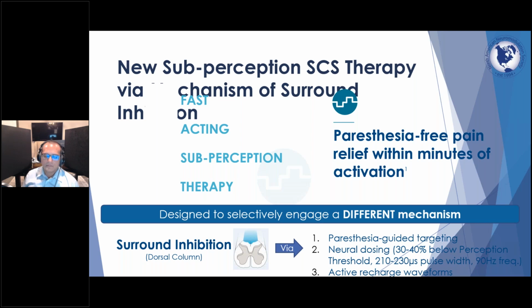There are a lot of different targets regarding spinal cord stimulation. What I did, from a clinical standpoint, was place the leads at the top of T11 and turn on the paresthesia mapping. She got great coverage of her feet. I turned on the fast-acting subperception therapy, and she had immediate 100% pain relief. The lady came in a wheelchair, and she literally walked out. Nurses were crying. It's a very dramatic thing. So while the theory of spinal cord stimulation can be dry, the clinical application is very relevant. Understanding the clinical application is very important.